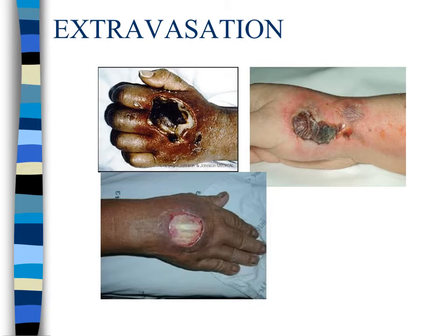Nursing interventions include immediately stopping the infusion and removing the device, elevating the affected limb, applying a cold compress to decrease edema and pain, and applying moist heat later to facilitate the absorption of fluid at the grossly infiltrated site. Discontinue the catheter unless an antidote is needed. Elevate the extremity slightly, have the antidote available, and start a new IV in the opposite arm.